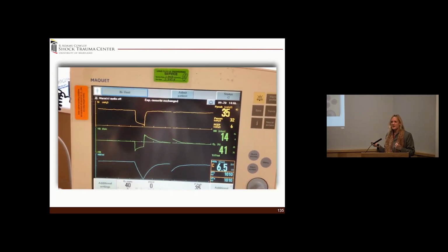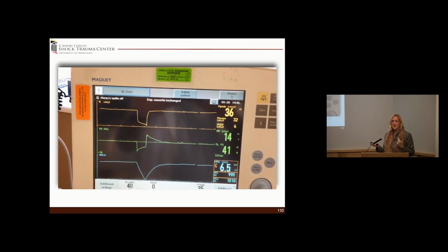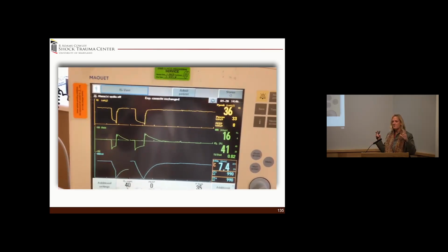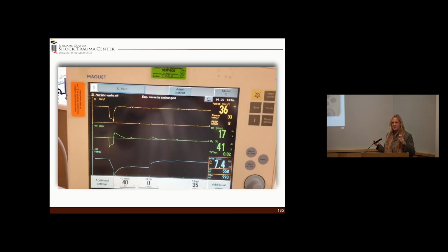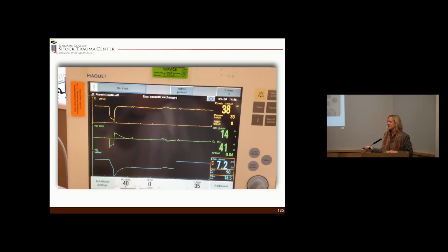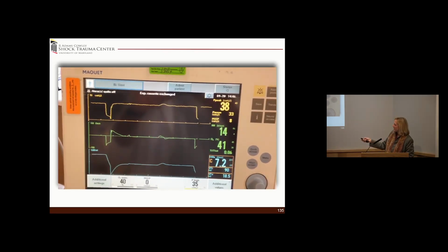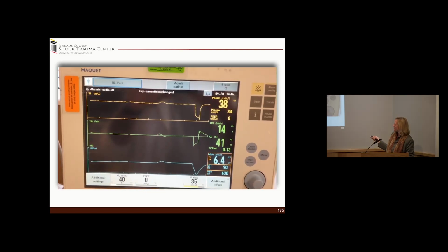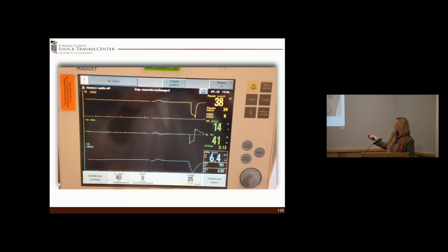This happens a lot of times if there's a leak, if the patient makes an effort, if there are secretions, anything that mimics a spontaneous breath. So it tries to synchronize and kicks out. So now it's back to its normal for a couple of breaths, and now watch, here comes, look at my volumes, and watch, here comes, there we go.